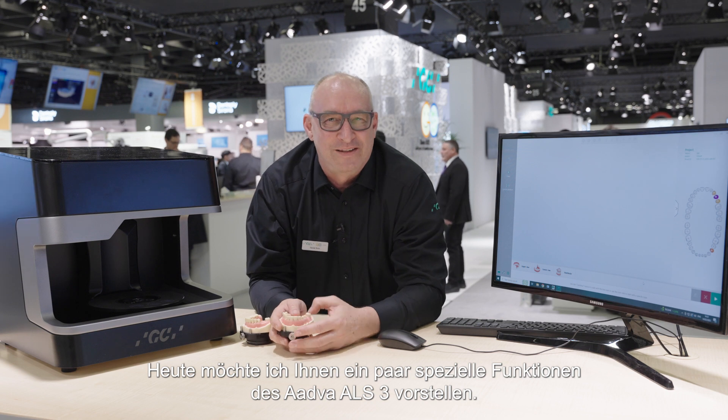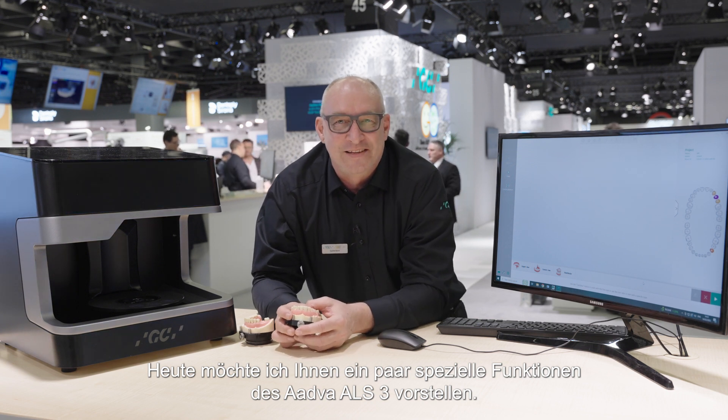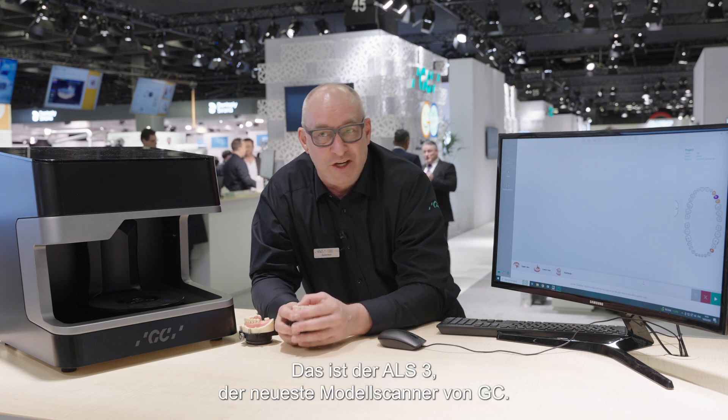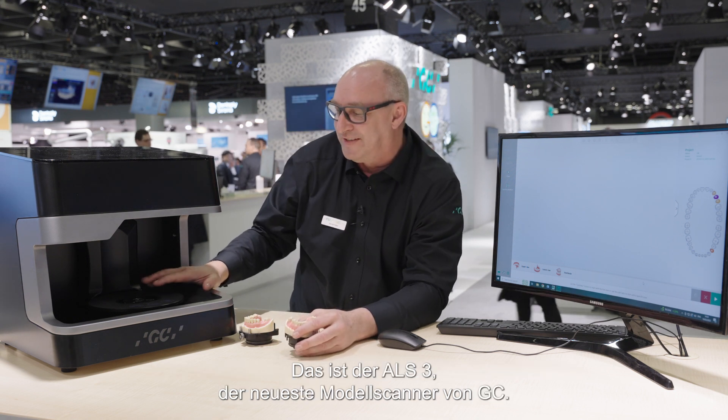Today I want to show you some unique parts for the ALS3 and some unique parts for the GC scanners. Here is the ALS3, the brand new GC scanner.